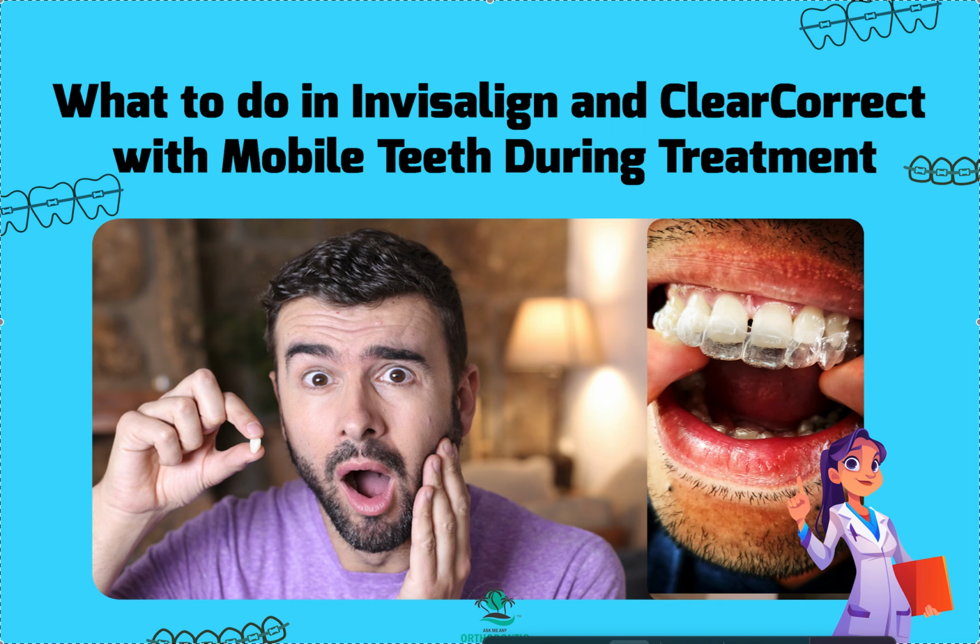So first thing I do whenever a doctor tells me this is, of course, I ask, how mobile is it? And did it start this way or is this something new? Okay. Once we get that information, like I said, if it's 1 or less, fine. If it's more than 1, okay, we've got to dig into it a little bit. So that's the first question.